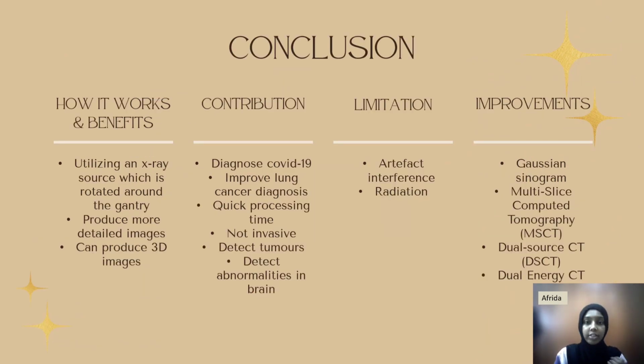By now, we have understood that CT scanners work by utilizing an X-ray source which is rotated around the patient. It also produces more detailed images and can produce 3D images as well. Some of the contributions of CT scanners are addressing the limitations in the diagnosis of COVID-19. It has also improved lung cancer diagnosis and has a very quick processing time of the images, is not invasive, and the most important of all, it can detect tumors and abnormalities in the brain.